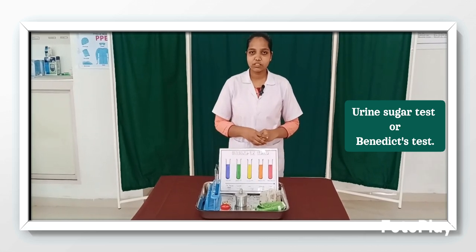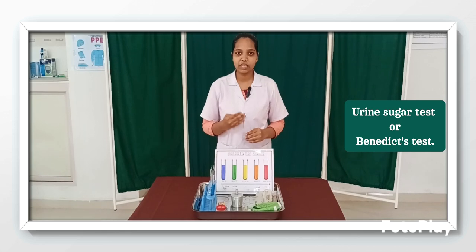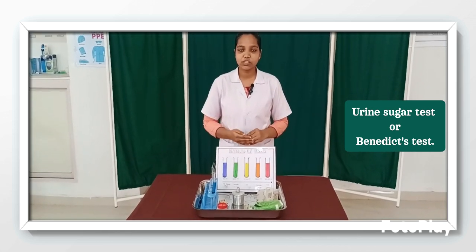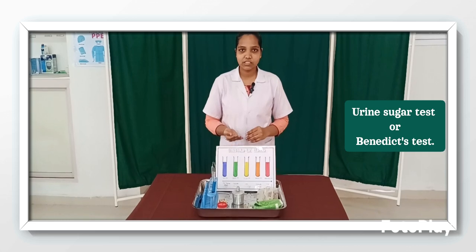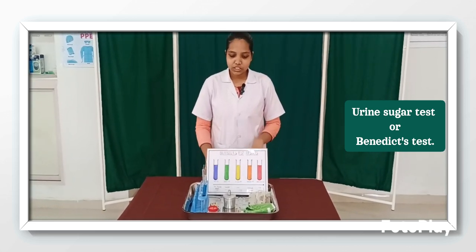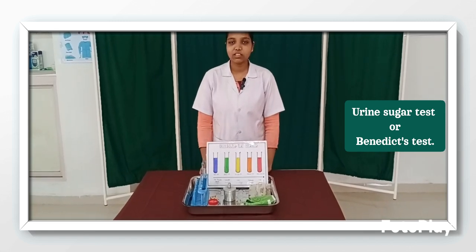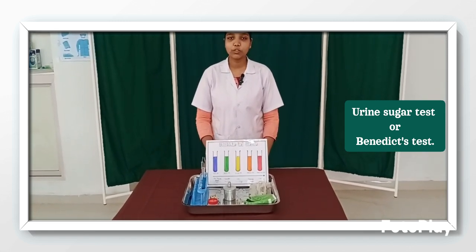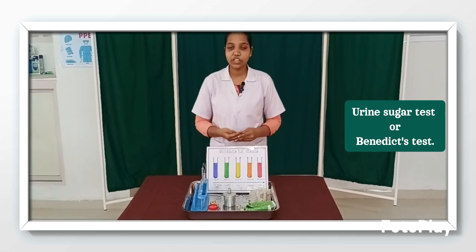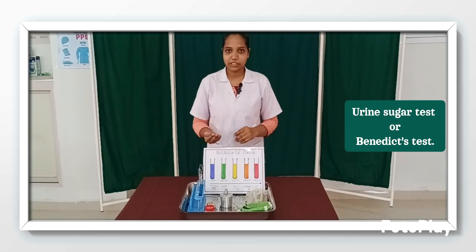So let's see the purpose. First we are going to check for diabetes in patients who are having diabetic symptoms. Then we are going to check in pregnant women to know the gestational diabetes, and we are going to check for renal glycosuria. Then let's see the preliminary assessment. In preliminary assessment, we are going to check the doctor's orders. In that, we are going to check what test we have to perform. Then we are going to check the patient condition.